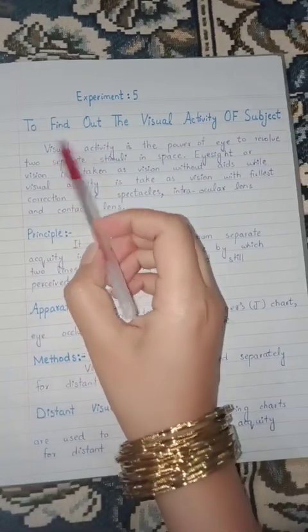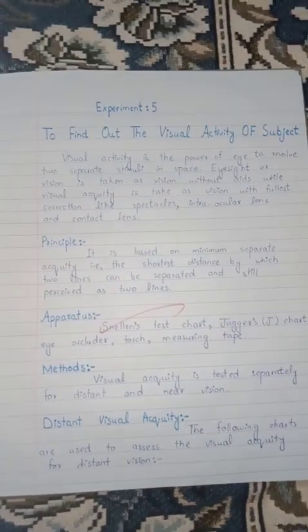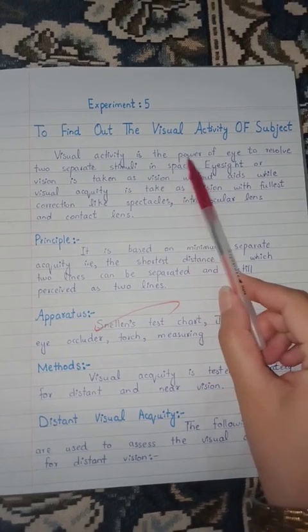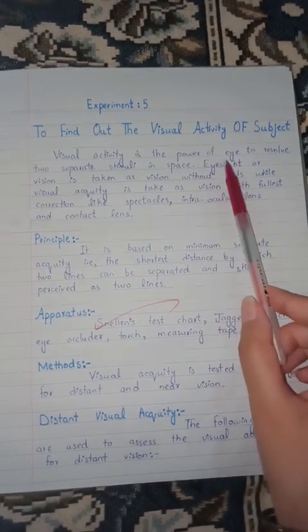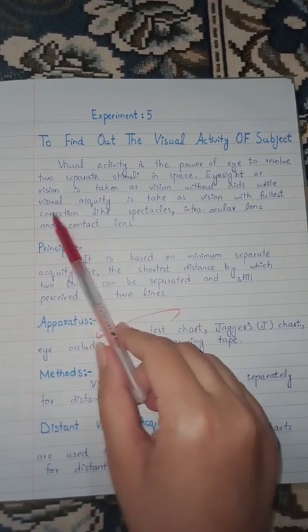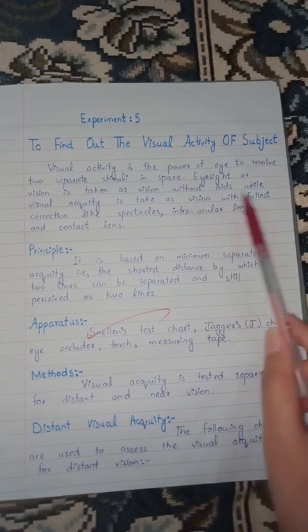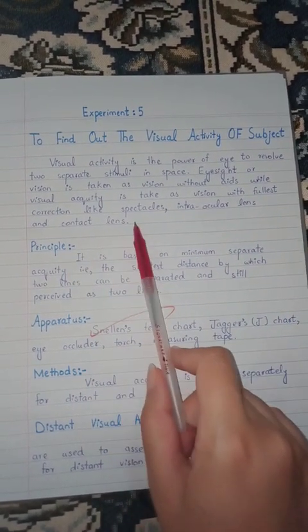Today we're going to discuss the practical to find out the visual acuity of the subject. Visual acuity is the power of the eye to resolve two separate stimuli in space. Eyesight or vision is taken as vision without aids, while visual acuity is taken as vision with fullest correction like spectacles, intraocular lens and contact lens.